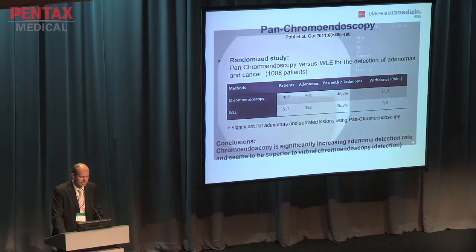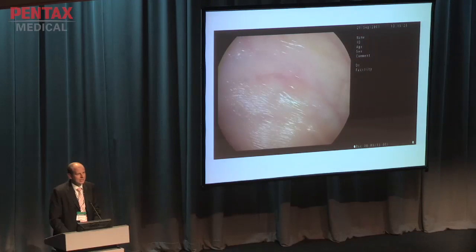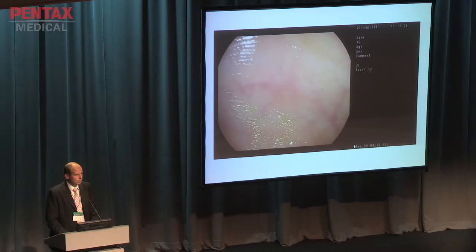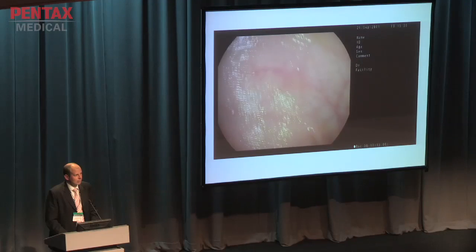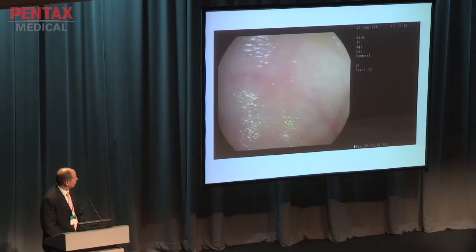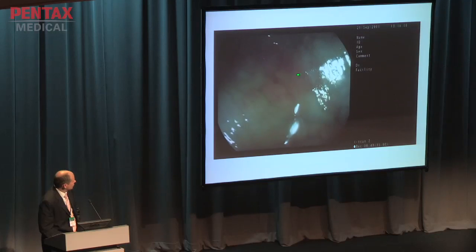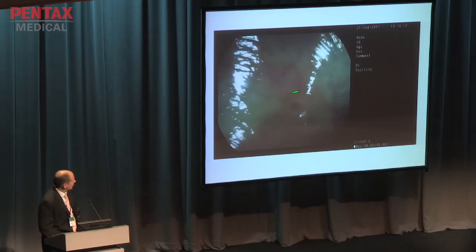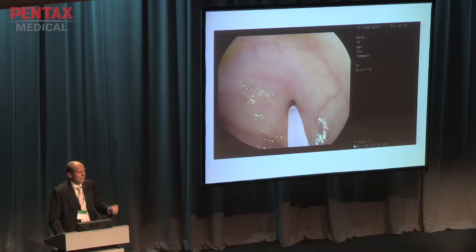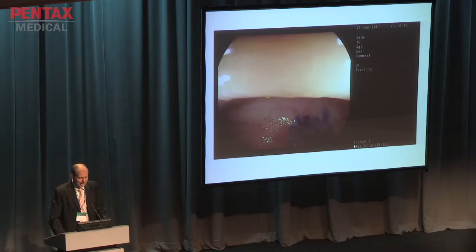To show you the difference and that you add something substantially if you do the staining is that video. There you see colon cancer. You don't see the colon cancer? Have a careful look. Maybe you use the i-Scan technology to have a very careful look at that area here. So now i-Scan on, and there's maybe erosion. Could you differentiate? Could you diagnose here? What kind of lesion is it in terms of Paris classification?